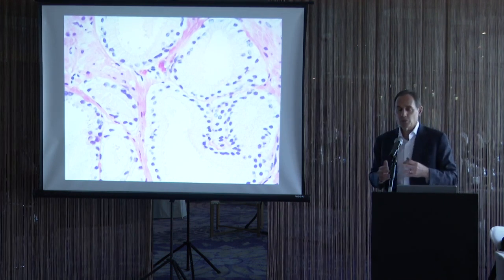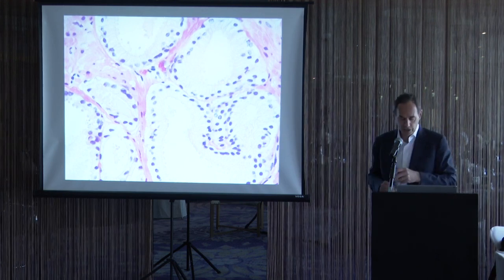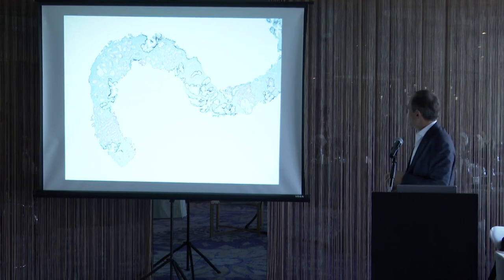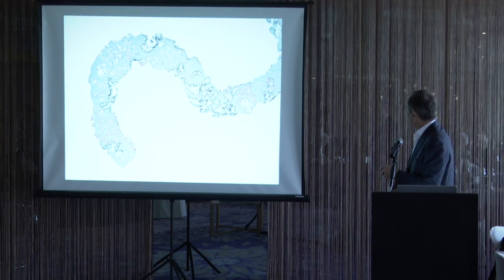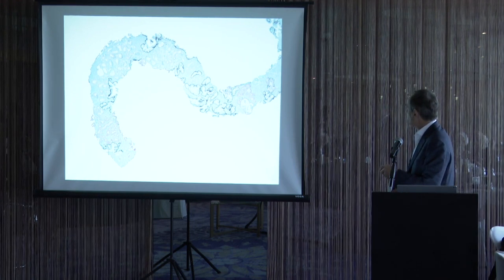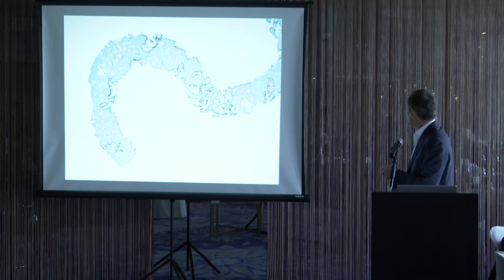This is a situation where you have to be extremely cautious, and I would not call cancer on the H&E, but sometimes in this situation, you can still diagnose cancer with the fact that you've lost the basal cells, and in here the red being the positive racemase, and the fact that it's infiltrating again in between benign glands. So adenosis, which is a mimicker of cancer that we'll talk about later, can have very crowded glands, but never has this infiltrative growth pattern in between the benign glands.